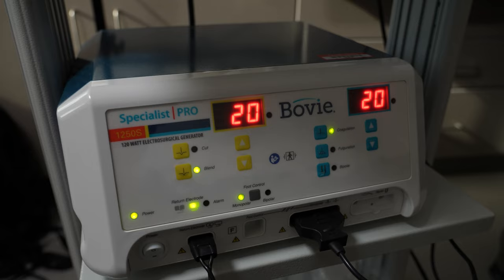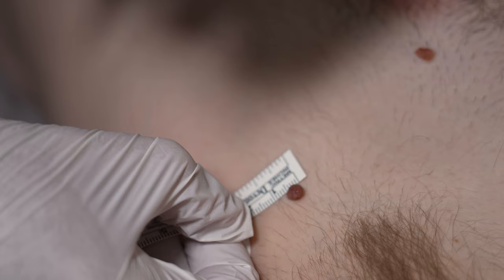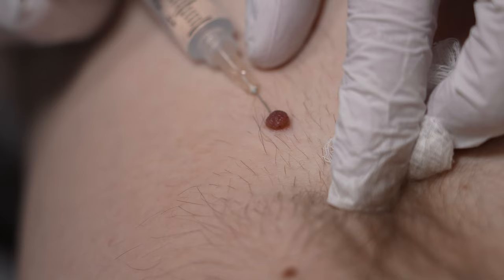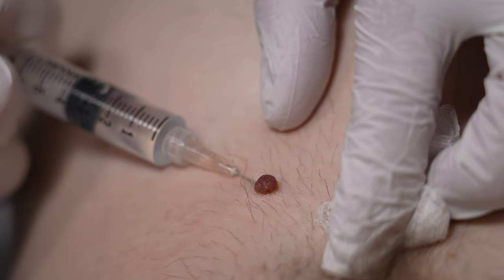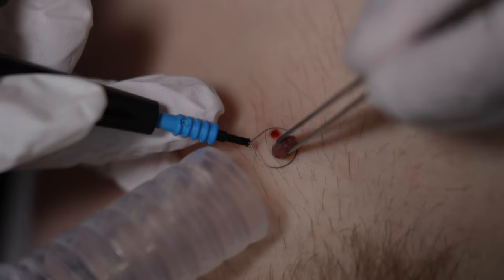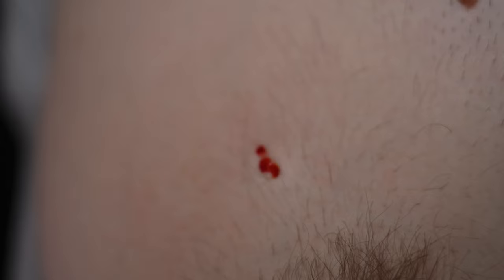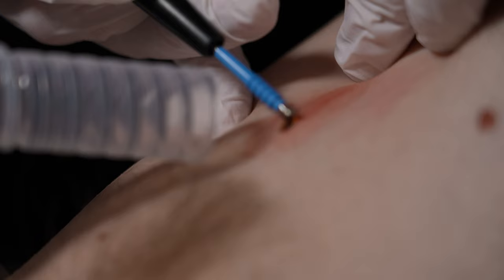We do so many of these and it's so nice to be able — in two seconds — to just get it off, and you're not significantly damaging the tissue, which is the better part about it. We're gonna call this left axilla. Beautiful. It's amazingly fast. Beautiful.